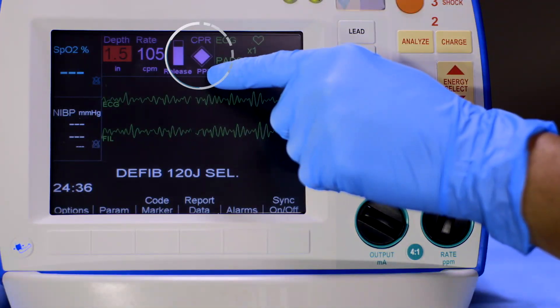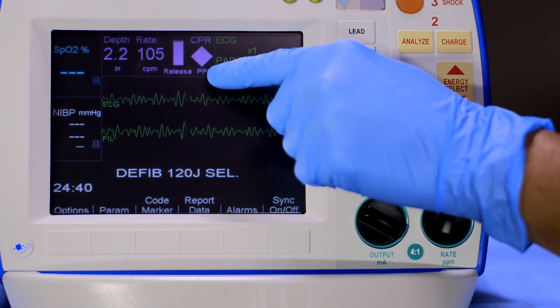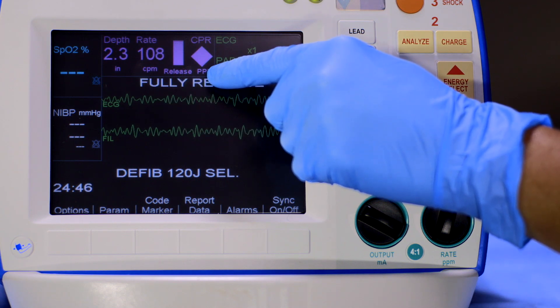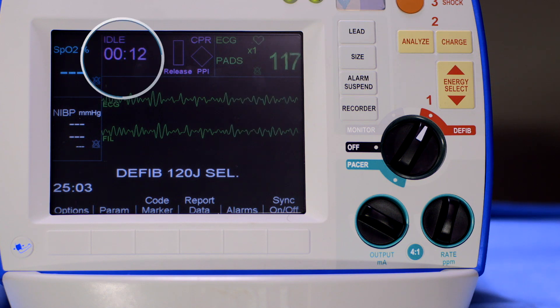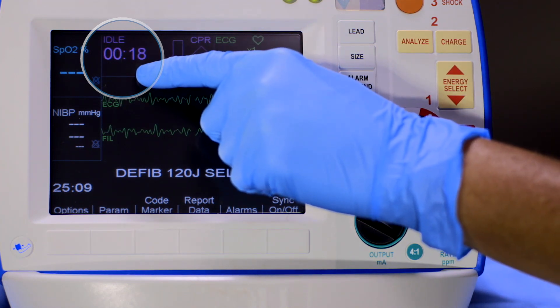The perfusion performance indicator integrates compression depth, rate, and interruption times into one visual indicator. Maintaining maximum value — a full indicator — provides visual indication of performance to the current guidelines. When compressions have been interrupted for an extended period of time, idle time is displayed in minutes and seconds. This is a visual reminder to help minimize pause time.